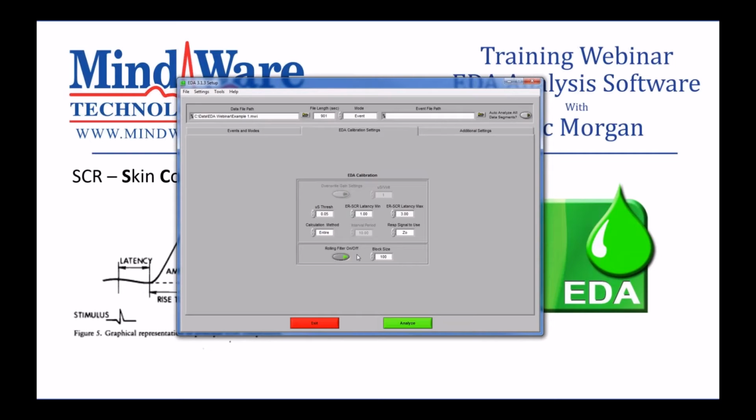And it's really good for removing some high frequency or unwanted phasic content in the signal. But it's also very powerful and can very quickly alter the EDA morphology pretty significantly. So as with all filters, we don't want to use them at first. We want to use them when they are needed. So I'm going to turn it off, and I don't believe this first file needs the rolling filter, but we'll look at some later that the rolling filter really helps out with.